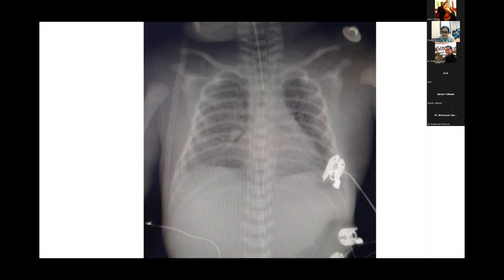It makes sense to have these kinds of pictures when you have infectious alveolitis. And nobody has really described that. We've described the more classic pictures with larger consolidations. And is it RDS because of the preterm thing? Is it a coupling with the infection that makes you have secondary surfactant inactivation? So probably a mix of both. I would agree with you. And this is what the clinical picture says. I don't know how the baby responded to treatment, but the ultrasound pictures make sense.